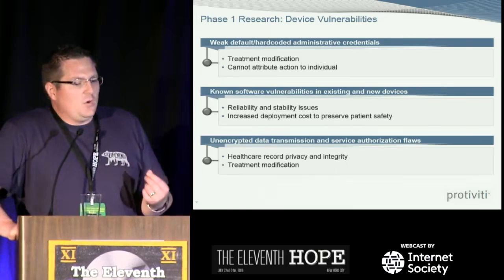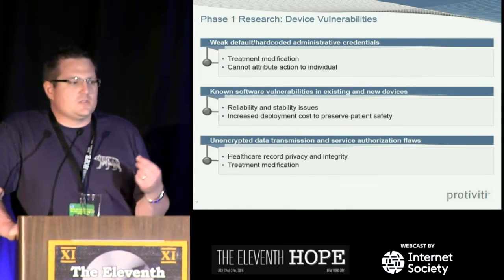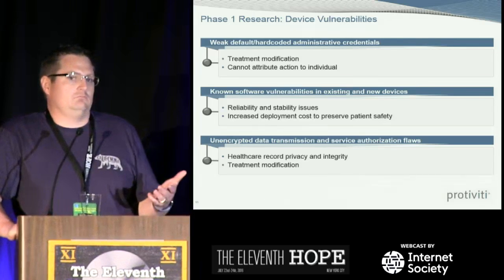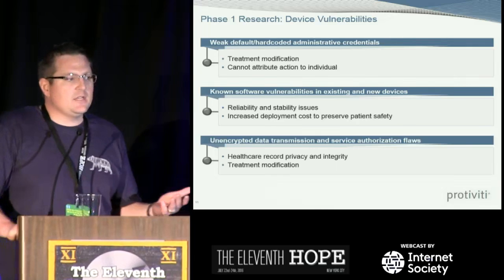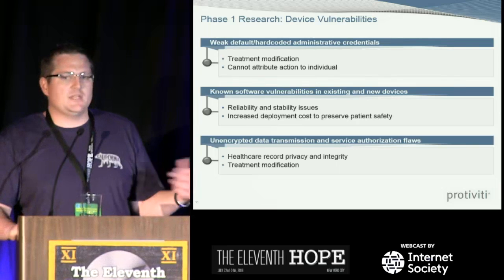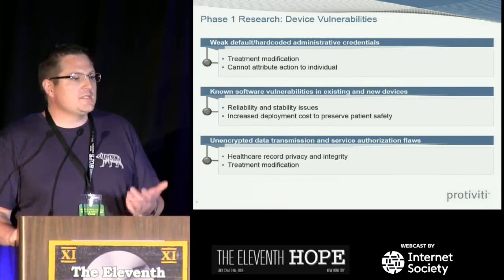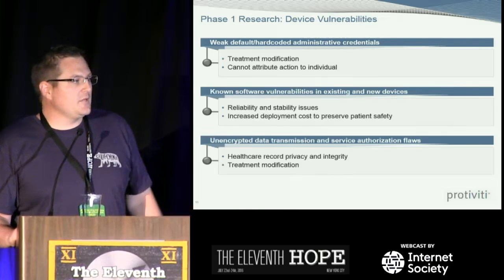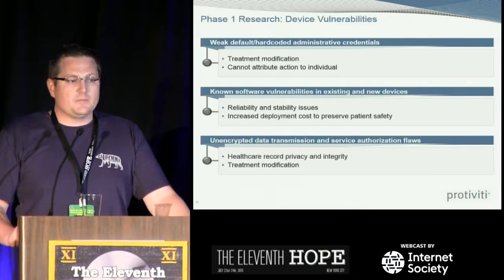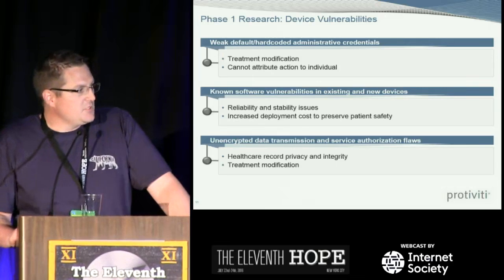But the first thing was, when we started to look at device vulnerabilities, are these advanced attacks, or are these really security hygiene issues that no one has fixed for years? And that's kind of what we found out. These are the top 3 big mistakes, or security hygiene issues, that we still see in devices implemented in hospitals, in the healthcare provider environment. The first one is weak default or hard-coded credentials, which I'm going to touch on later today and show you some of the awesome passwords that these systems use.